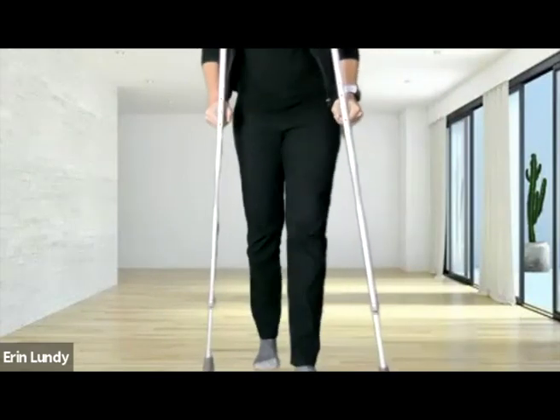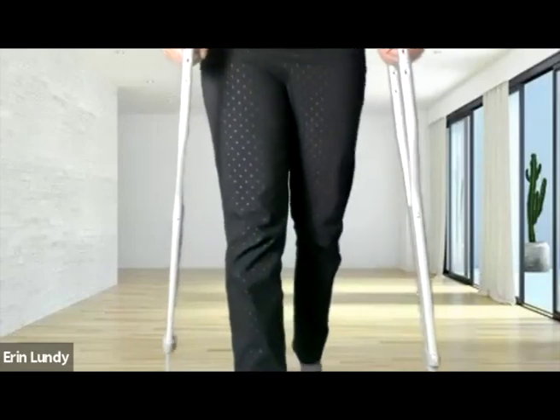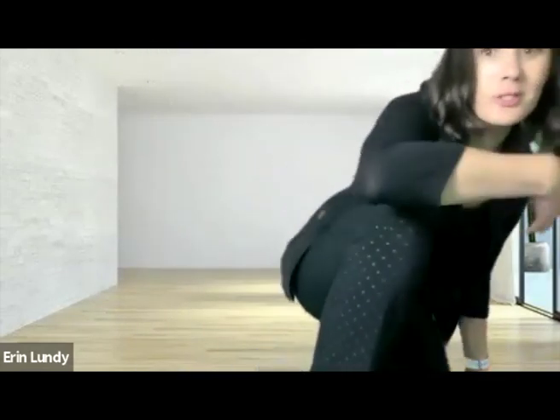Because this is a cool way to say, again, I'm gently introducing this, and you have control in order to take some of that pressure off your kid's leg as needed. So there are two more techniques that I want to go over. One is called swing through and one is called swing to gait pattern. And actually I hear a lot of therapists get this confused a lot. Okay, so we'll go over it step by step.